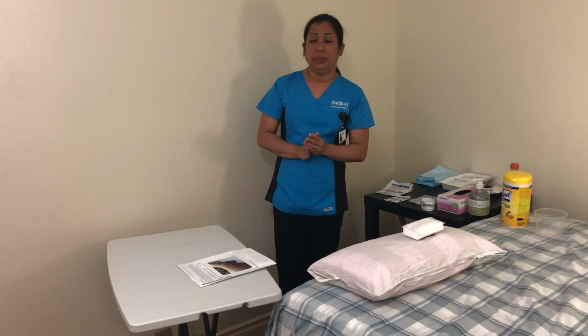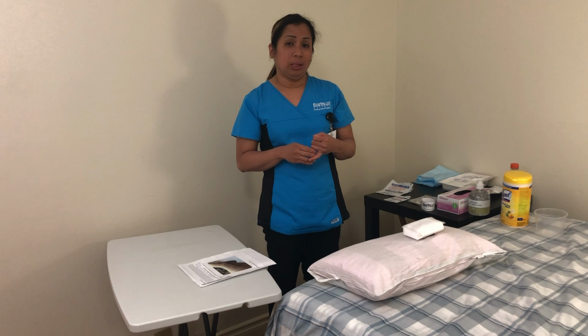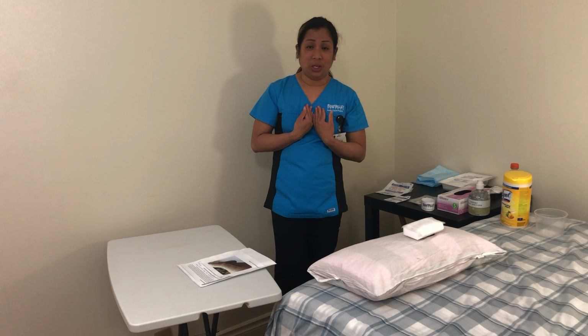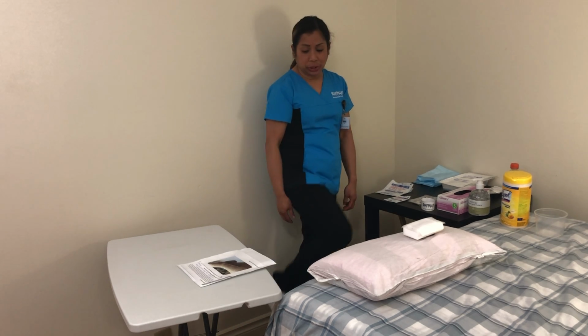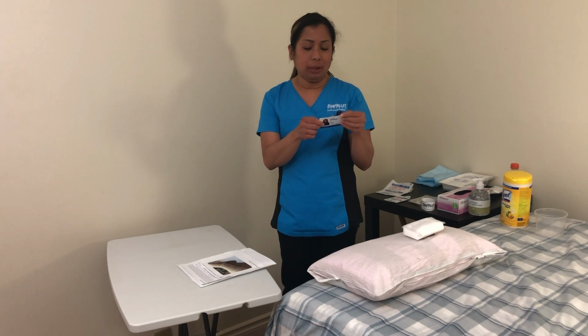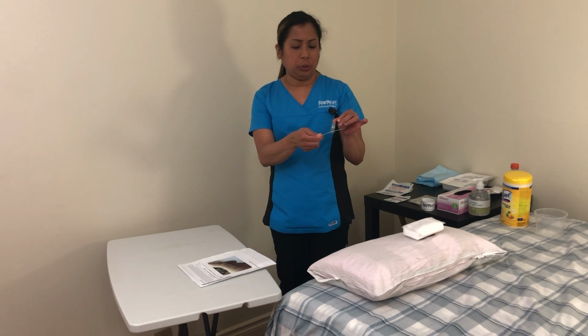Hello, good afternoon. Before anything else, I'll do the procedure, which is the removal of the staples and applying sterile strips. I'm going to introduce myself first. My name is Ivy Luzon das Cabralius, and this is my complete uniform with my white shoes, and this is my ID. My student ID number is 3822292.